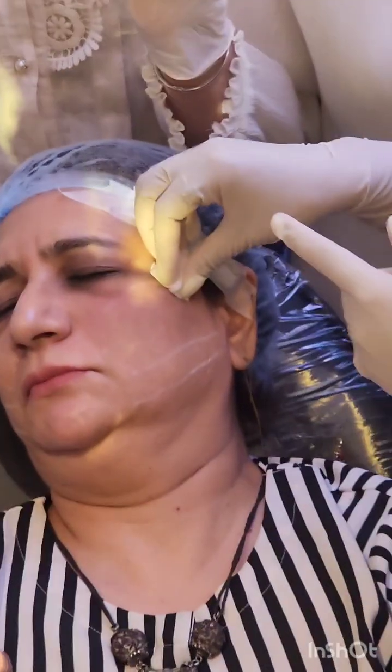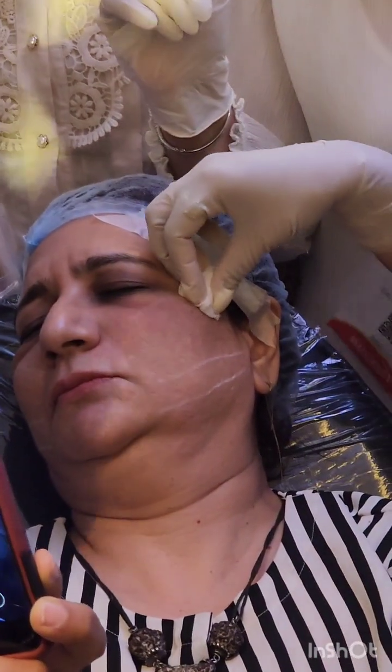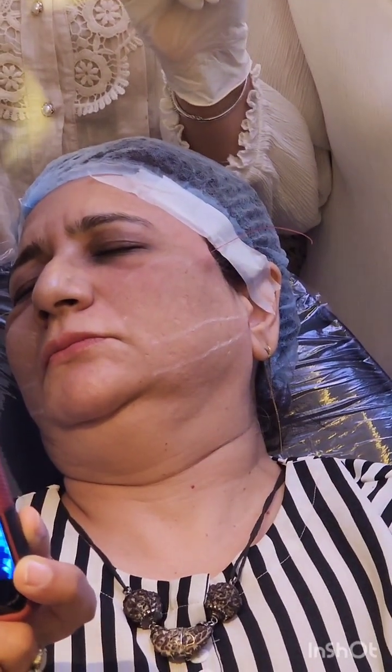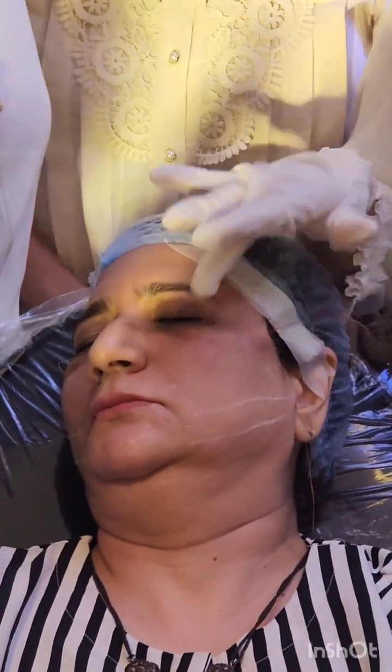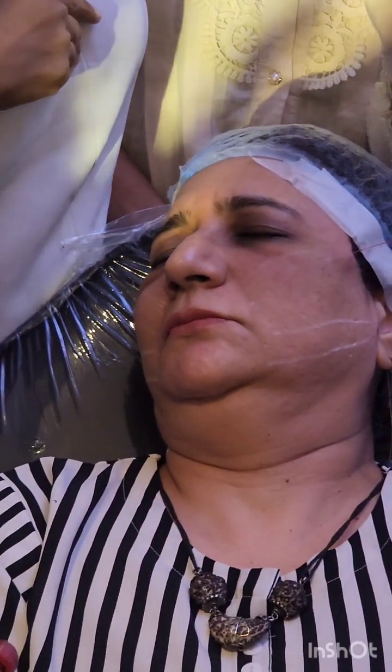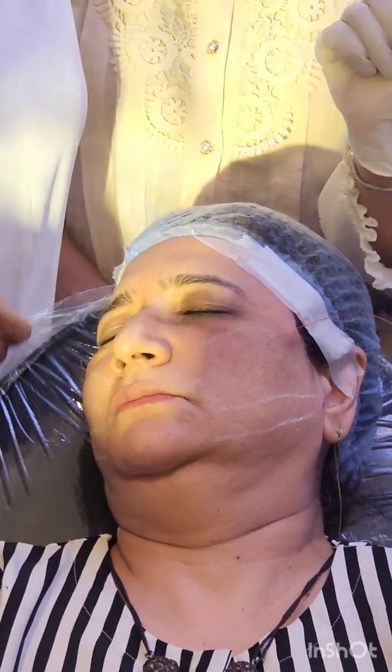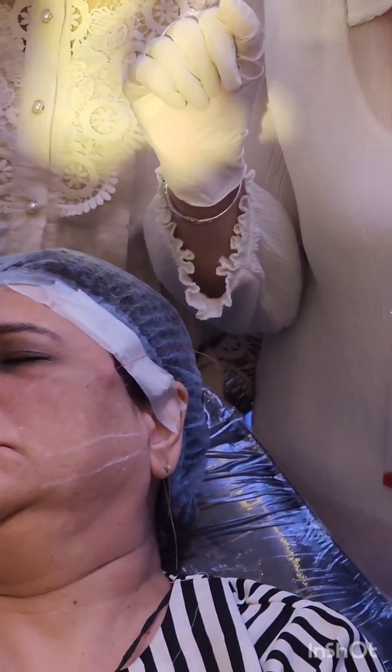Sorry, I'll do it this side. It has already become sore, so I'll let you try from this side. Pull the skin as well. Here also gets that. When you actually pull it from here, it ended from here. Here it is directed towards here.